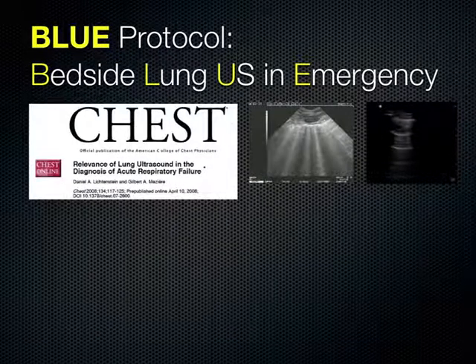Daniel Lichtenstein of France is one of the key fathers of pulmonary ultrasound in critical care. He developed the BLUE protocol to diagnose causes of acute respiratory failure. He did this by taking patients with a diagnosis of acute respiratory failure and scanning their chest. He did this alongside the usual diagnostic tests, including chest x-rays and CTs.